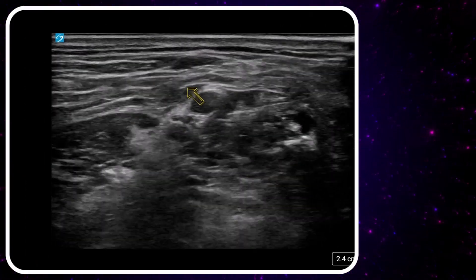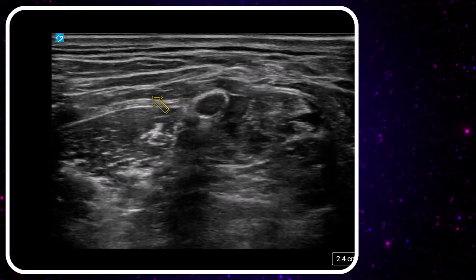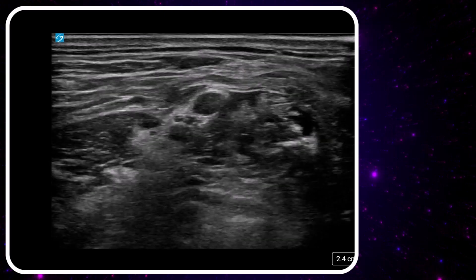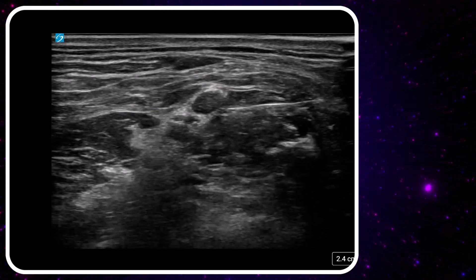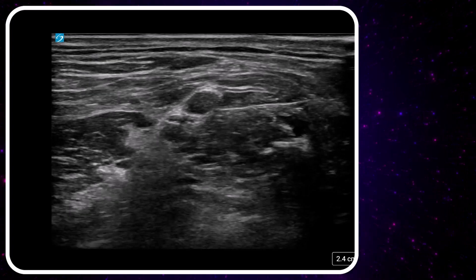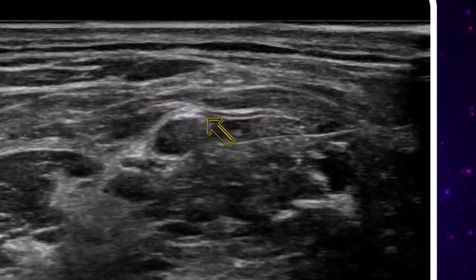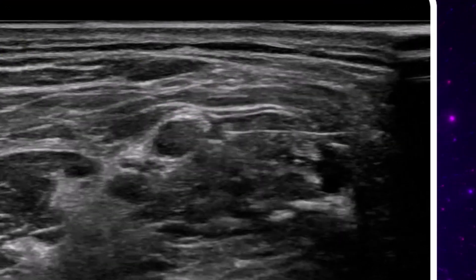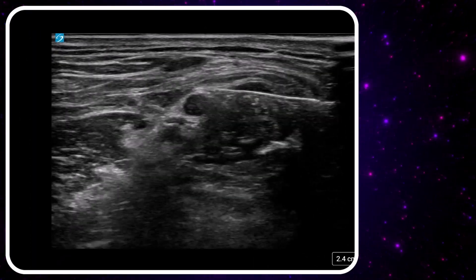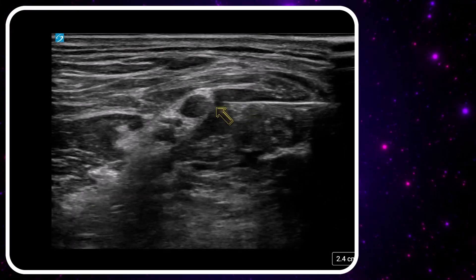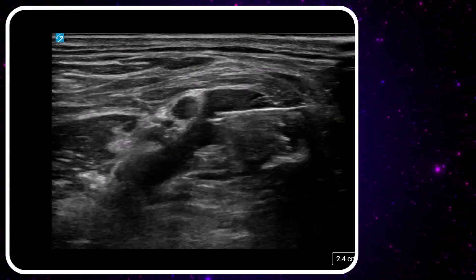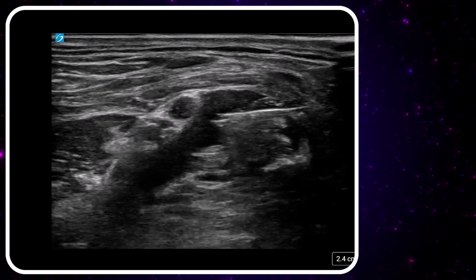Keeping in mind we have our transverse cervical artery here, one thing we can do sometimes to improve our local anesthetic spread pattern is to sit just on top of C5, give it a little poke just past the fascia — which we'll do now. Just into that space there, and now you can see the local anesthetic really spreading down there. It's quite a significant difference.